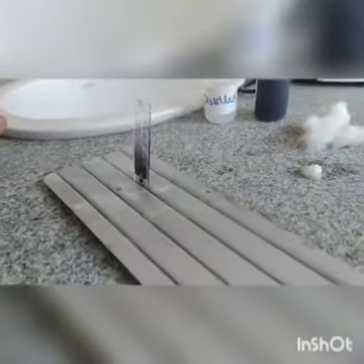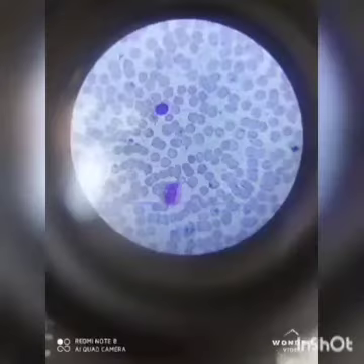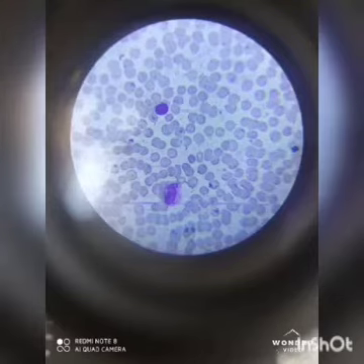Then after that we will observe under the microscope. Under high magnification, the red cells are stained orange pink and appear as numerous non-nucleated biconcave discs. Other leukocytes: there are mainly 5 types. These are neutrophils, eosinophils, basophils, monocytes and lymphocytes. They are all larger than red cells. They are differentiated depending upon size, nucleus, cytoplasm and cytoplasmic granules.